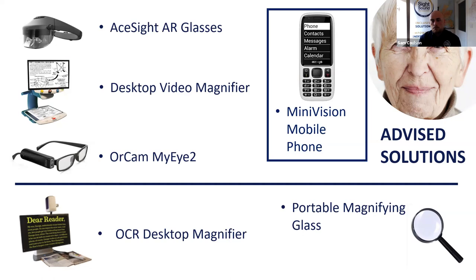So any messages, for instance, that are sent to her will be read out loud. Any notifications, you have a text message, you have a missed call, that sort of thing. Everything is read aloud. And she can even speak into the phone and say, call Sam. She can dictate text messages. So it's very useful, especially for somebody of Catherine's age who doesn't want an all singing, all dancing mobile phone. Something very basic, very simple, but really useful, especially in the current environment.